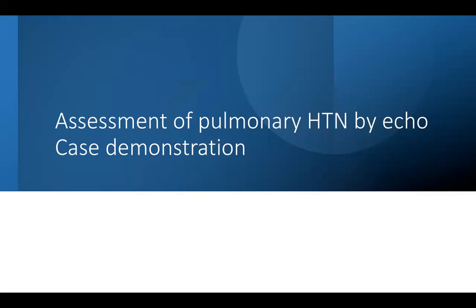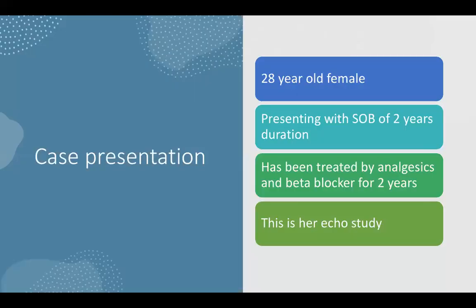This is a real case. This is a 28-year-old female presenting with shortness of breath of two years duration. She has been treated by analgesics and beta blockers for two years. She came to me and this was her echo study. This is how you perform an echocardiography when you suspect pulmonary hypertension during the case.